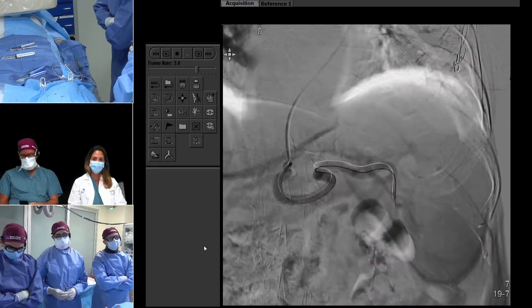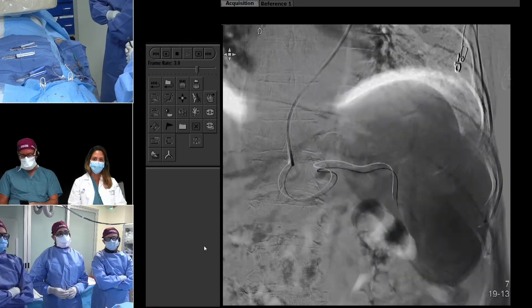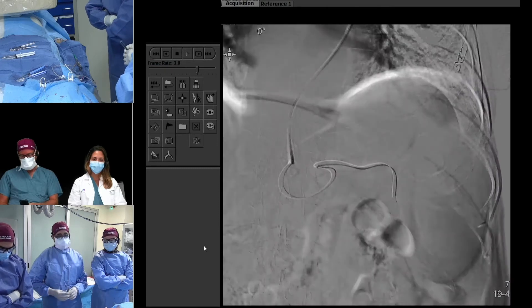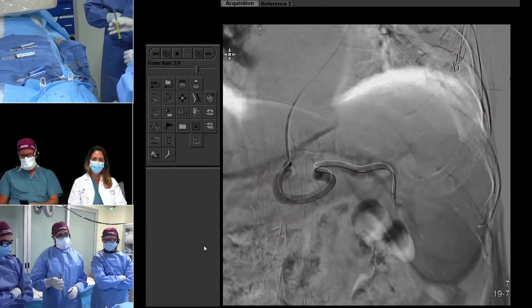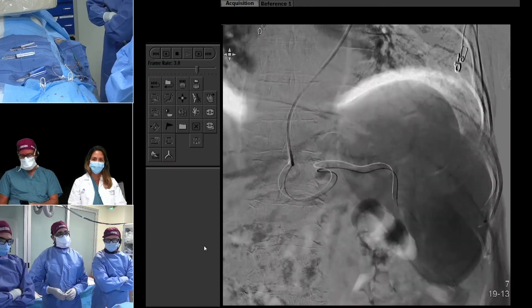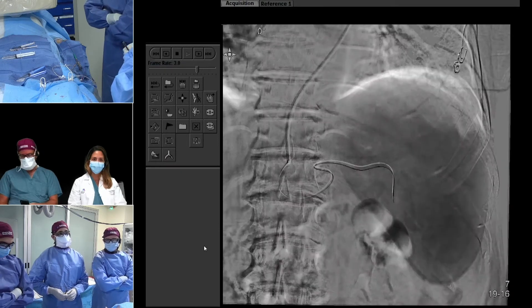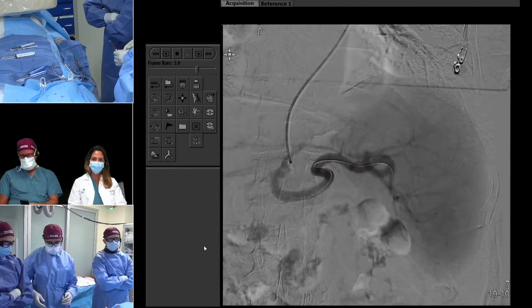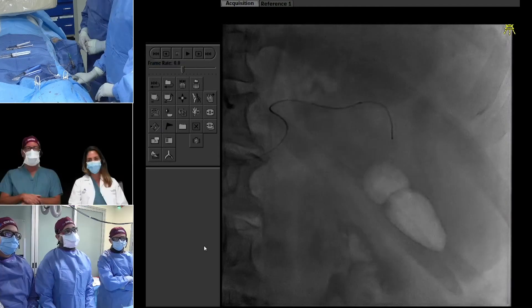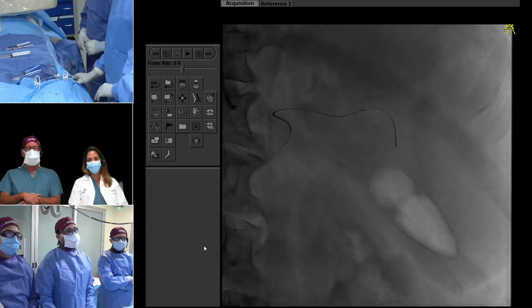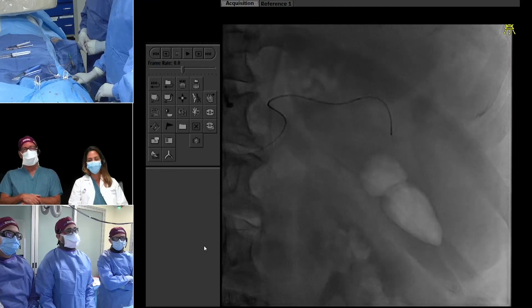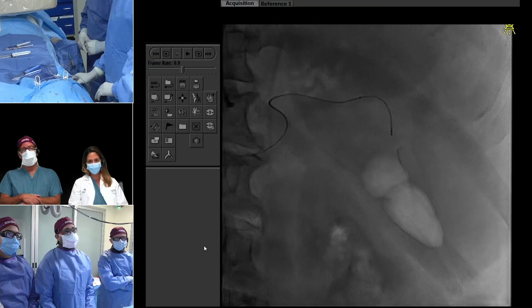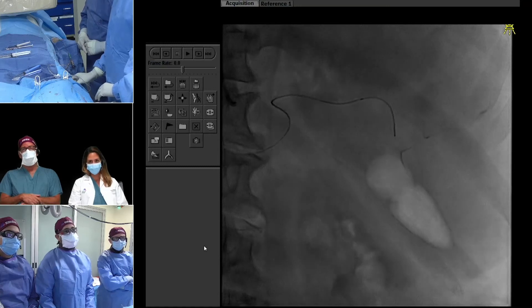We have a low-flow microcatheter, a 2.4 French Progreat out, which is DMSO compatible. We've loaded the DMSO, I've drawn up my Onyx, and we're ready to go. We'll do this branch, and luckily since we have the guide, we don't actually have to pull everything out — I'm a little concerned we're going to lose access if we try to pull everything out.